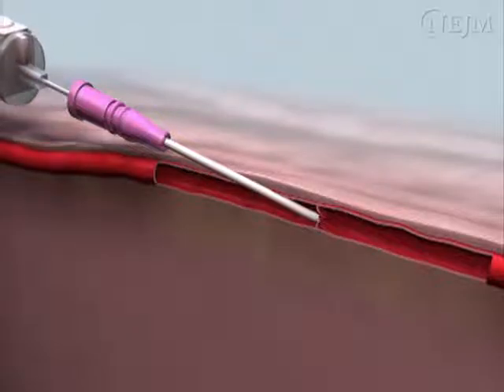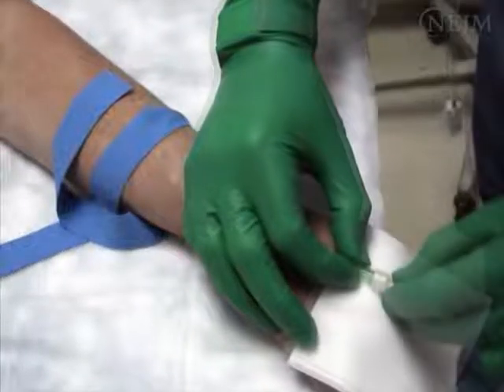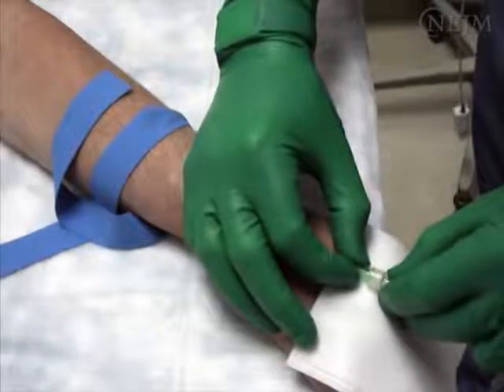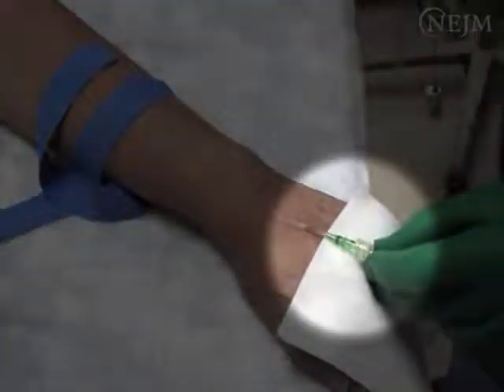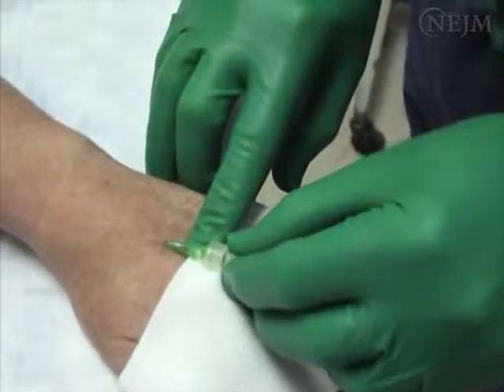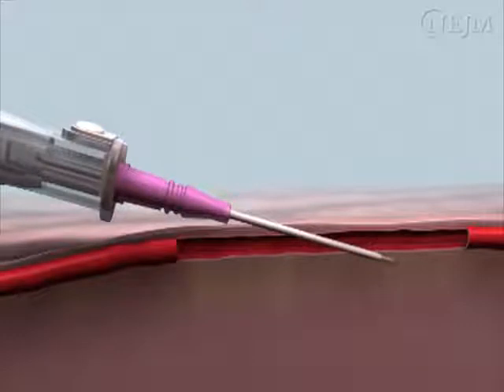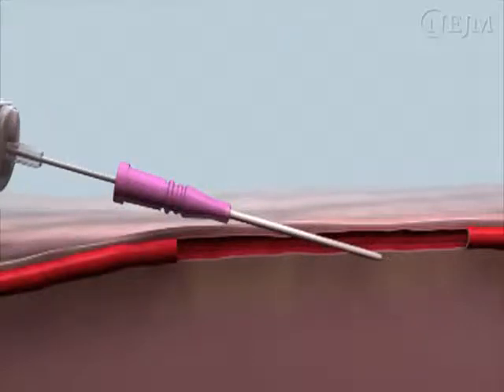A valve within the vein may prevent advancement of an inserted catheter. If this occurs, hold the cannula hub in place, remove the tourniquet, and connect the intravenous tubing to the cannula. Running fluid into the vein may open the valve and allow the cannula to be completely inserted. Occasionally, it is possible to advance the catheter when it is outside the vein or when the catheter has perforated the vein's opposite wall.